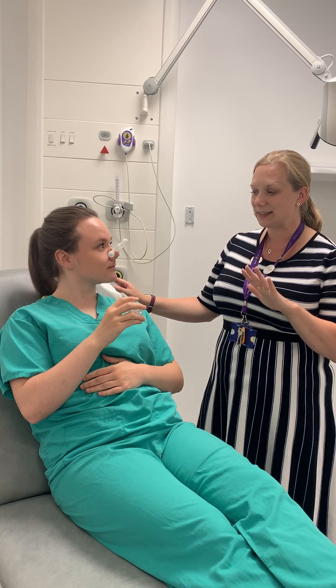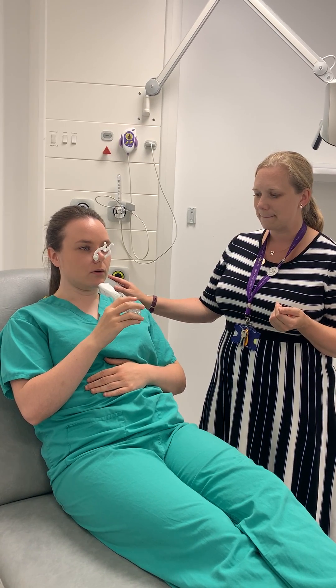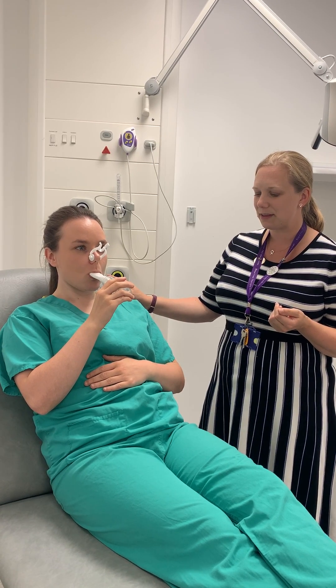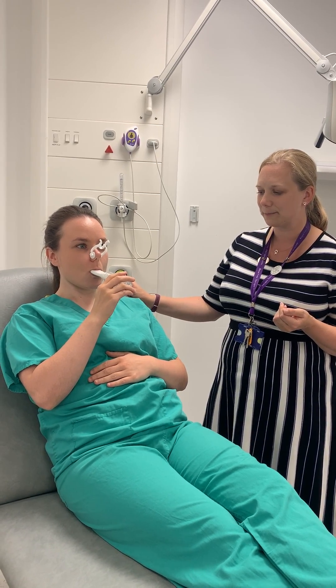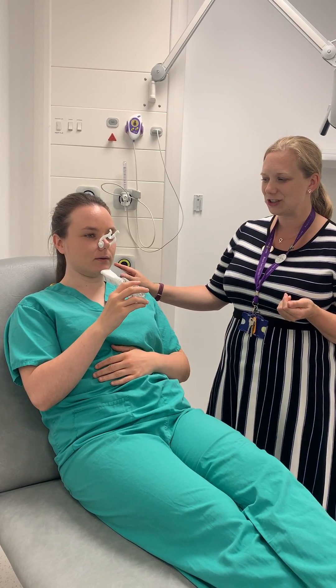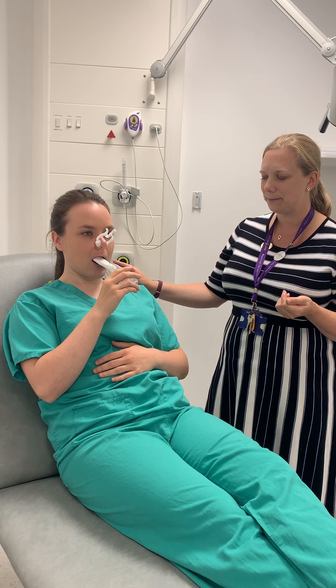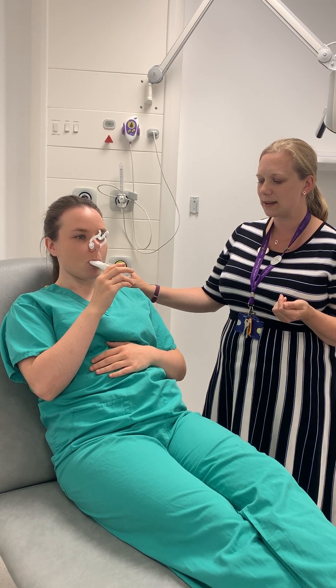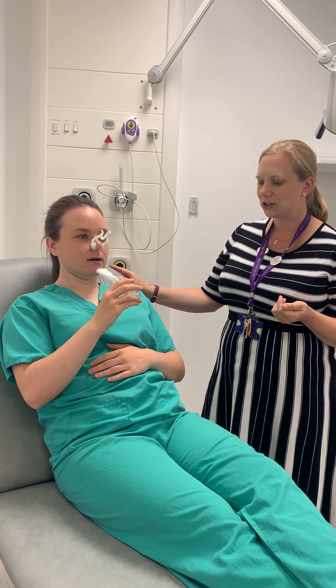And we do five breaths in a row. So can you do three more? Good, so all the way out, nice deep breath in, feel the tummy expanding, all the way until you can't get any more air in. Two more. Deep breath in, all the way in, fill your lungs up with air.